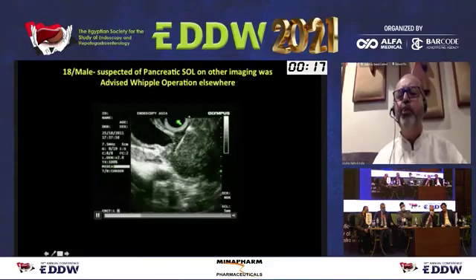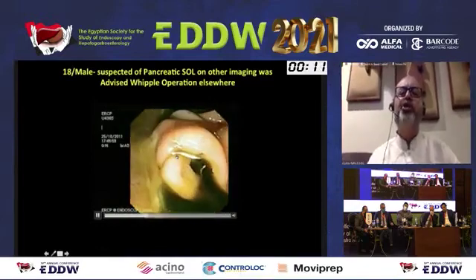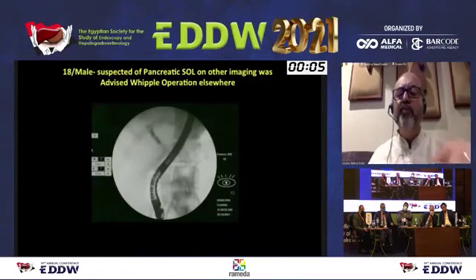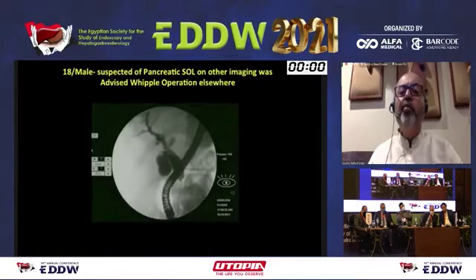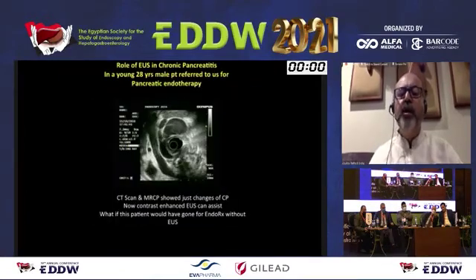I usually do a biopsy just below the stricture of the bile duct. Now, this is the CBD stricture, so I usually go very close to the stricture of the CBD, and that's where you get the proper diagnosis. And why would only ERCP not have been enough? Because we did ERCP for draining of the biliary system because the patient had jaundice. So brushing was negative for diagnosis. So only ERCP would not have worked in this case.